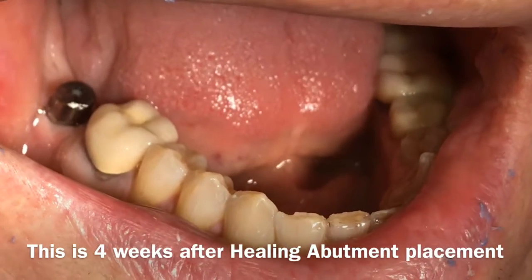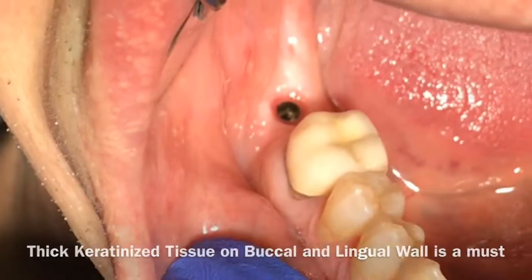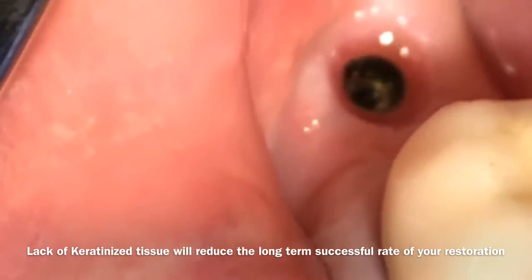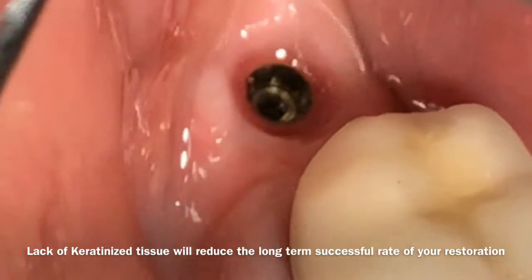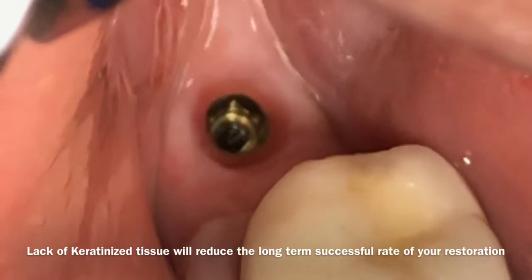The tissue is supposed to look nice and clean like this, and you can see the buccal keratinized tissue. That is a typical area where people have a lack of keratinized tissue and you would worry about it. When you have a thin biotype, you have a high risk of gum recession and potentially the implant will fail.